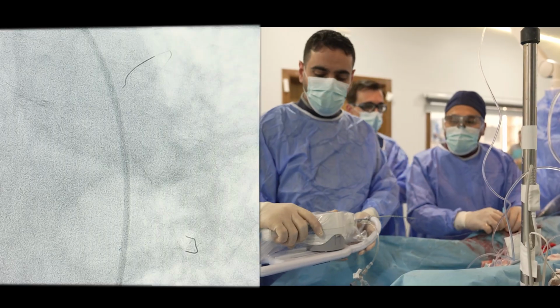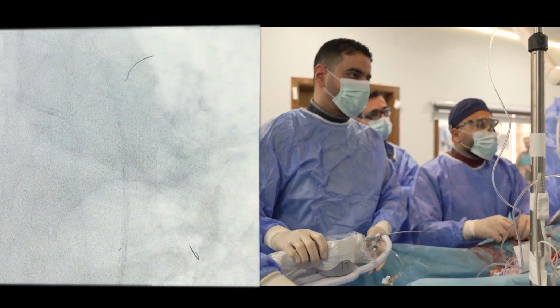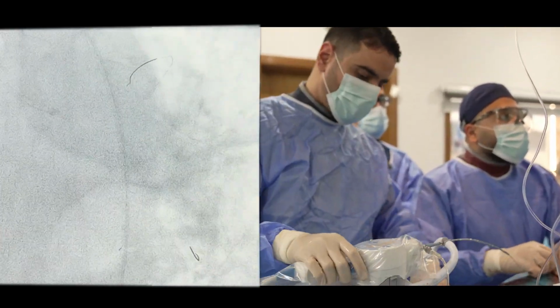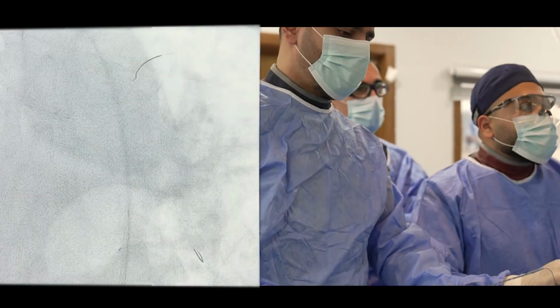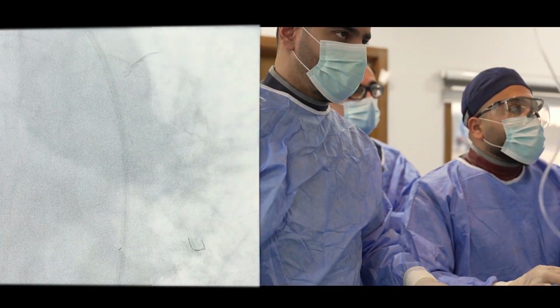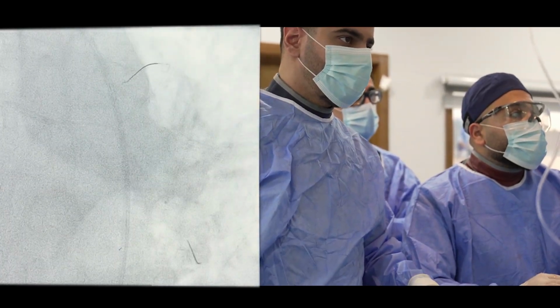Okay, still. Go. Okay, go. Some difficulty. Push the guide a little.